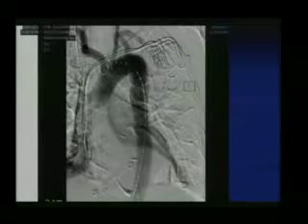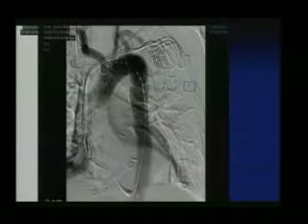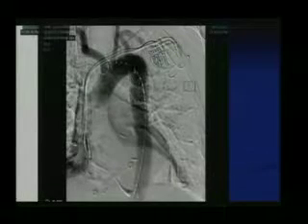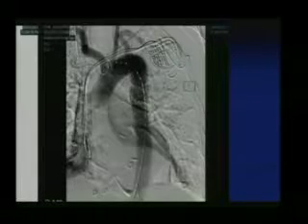So type 1A endoleak can be fixed by putting another cuff, extending it, but it all depends on how your arch vessels are here. You might have to do a carotid-subclavian or carotid bypass or a debranching from the ascending aorta to get the coverage. The other thing is endo screws have come up recently, so you can go percutaneous again.